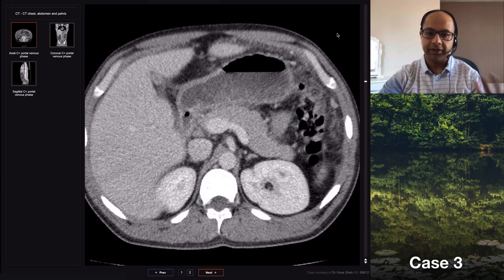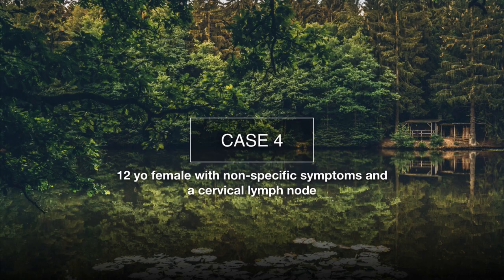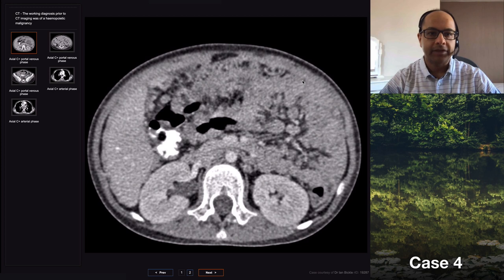Case number four is a quick one with just a few still images. This is a 12-year-old girl who had non-specific symptoms and a palpable cervical lymph node. The working diagnosis was a hematological malignancy, which is why the CT was done. Several axial slices of the abdomen and chest have been provided with both oral and IV contrast.